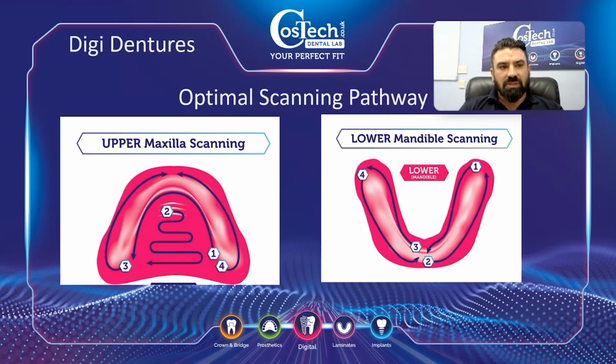The main thing when you're scanning soft tissue is that you lose the reference points. If they've got one standing tooth, the scanning system will actually use that as the reference point. With soft tissue, a bit of saliva can go in and suddenly mess up the reference points. So what we found is basically taking from the post-tuberosity, going from point 1 all the way around mesially and then distally again, and then the palate, this is on the maxilla. That gives you your first reference point.